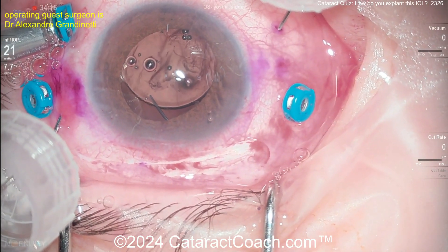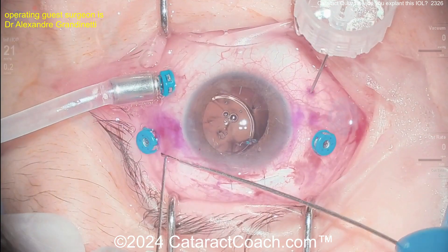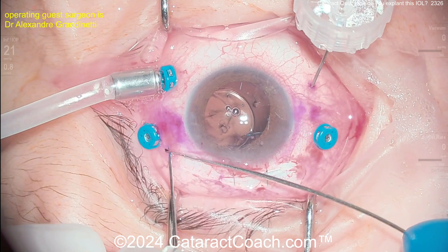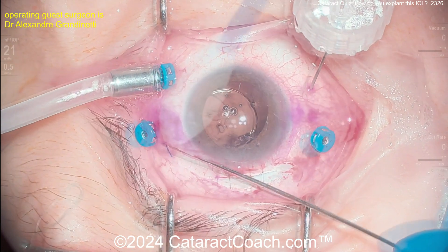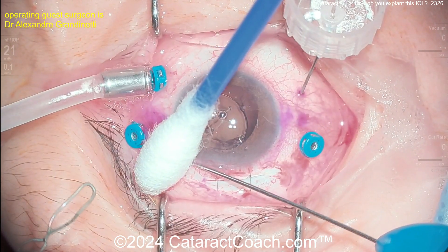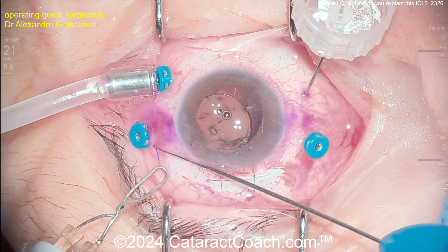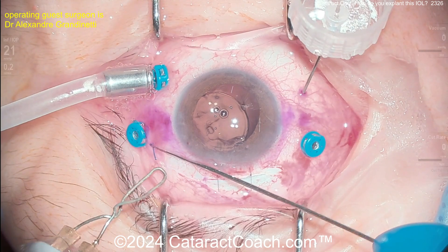I like the twist-and-out technique the best — it's very effective. Cutting a lens inside the eye is also great. But if you have a case like this where you're trying to do as little damage as possible to a delicate corneal endothelium, doing something like this with a scleral tunnel may be the best bet.